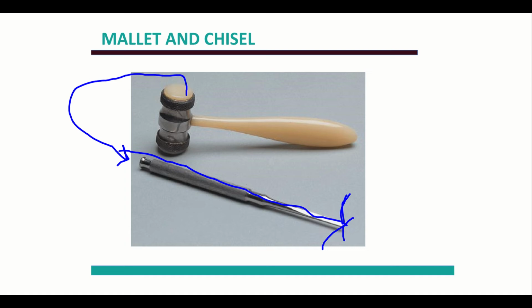My son was just telling me the other day, he works in an oral surgery office, and they did this the other day. And interestingly enough, often the doctor will place the chisel where they want it, and then the assistant is the one who actually takes the mallet and hammers the end of the chisel as instructed. I've never done it before. Sounds crazy, right?